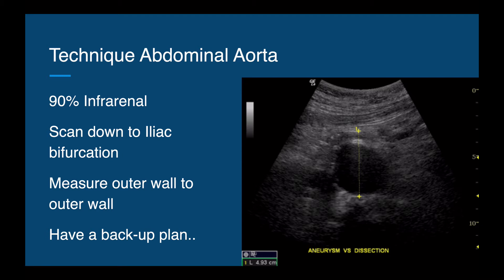For our technique for the abdominal aorta, we know that 90% of aneurysms will be infra-renal. We will scan from just below the xiphoid down to the iliac bifurcation, around the umbilicus. We measure outer wall to outer wall to get the biggest diameter. Oftentimes in the mid-abdomen we can't see everything because bowel gas will be in the way, so we will always have a backup plan.